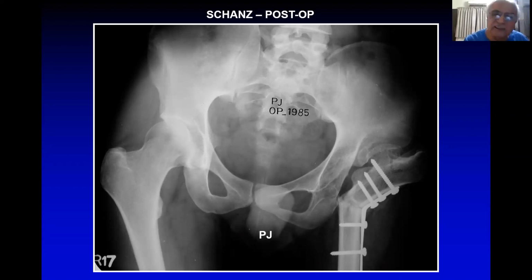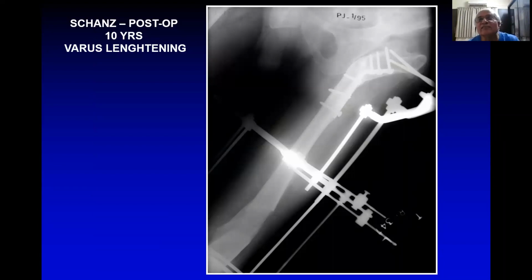So this patient came after some time for lengthening, and my boss was not doing Ilizarov. So he asked me to do Ilizarov. Well, I did Ilizarov for this patient, and look at that, I had to go into the varus. So I left the plate there because it was many years, 10 years. So I tried to negotiate a couple of this one.